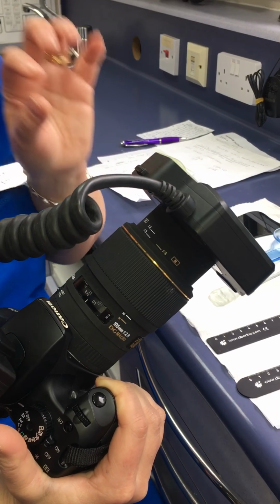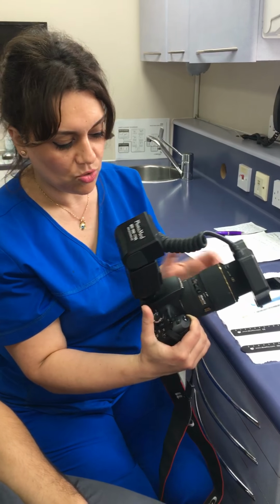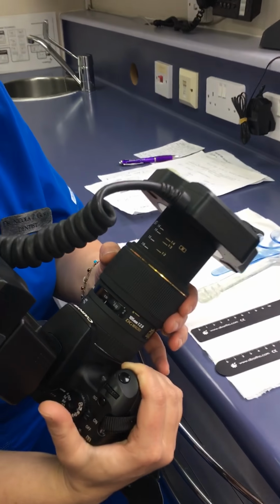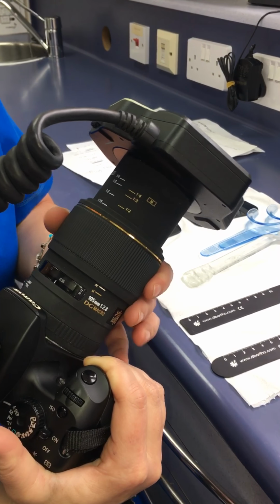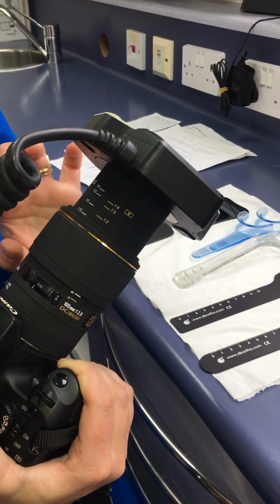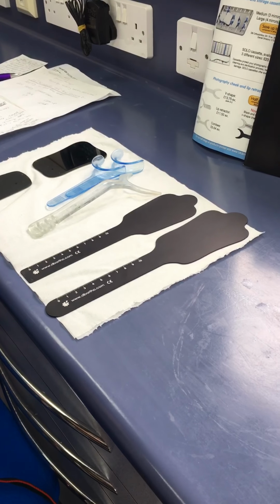If you are taking a very close up of, say, 2 central incisors, then don't change anything. The only thing you need to change is the magnification ratio, and you want to put it to 1 to 1.5 and lock it into place, or 1 to 1. For those photos you could use these contrasters to take photos with.